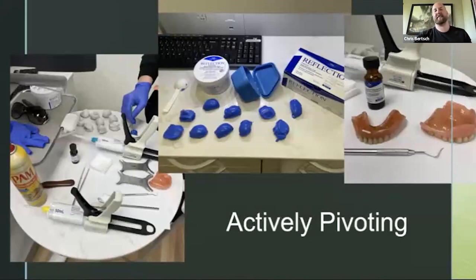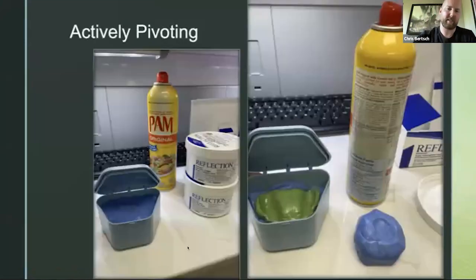And then you mix up the base and catalyst and push it on the top. I'll have a picture that better shows it coming up. So right here, that's what the denture looks like going in. Then you just take that other blob of putty and pack it around into the ridge around the whole denture, make sure that it's got all the detail that we need, and then you let it set up.